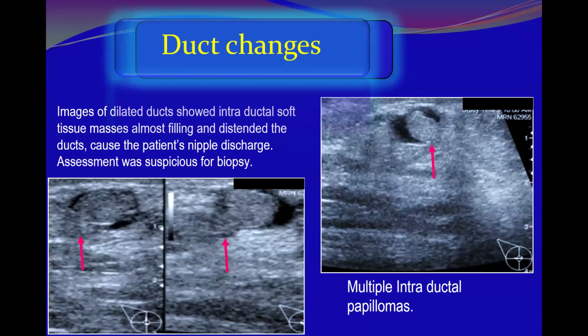This is my patient also. Here you can see the attachment. Can you see the attachment? This is a ball surrounded with fluid here, but at this location, these lesions are also attached to the wall and not moving.